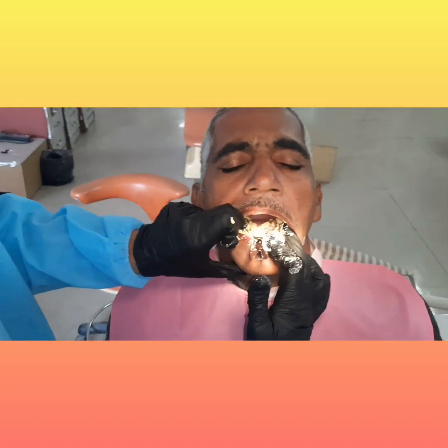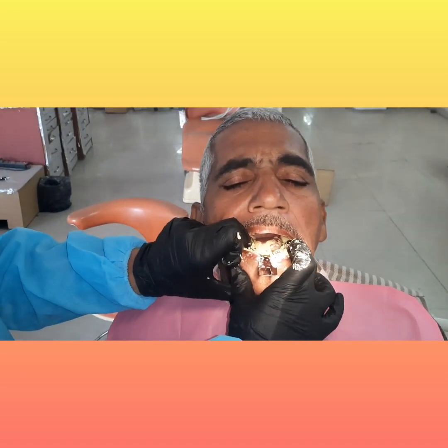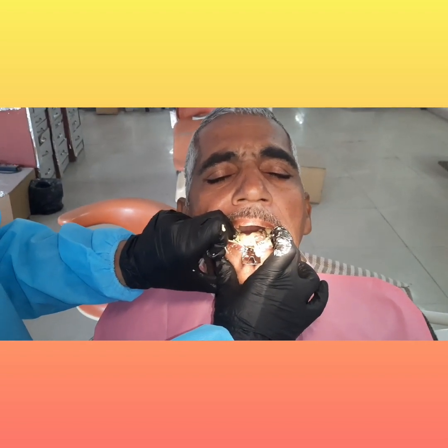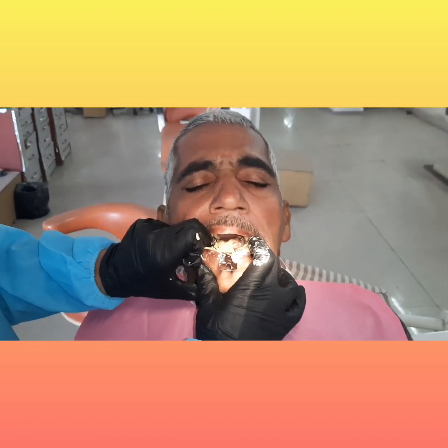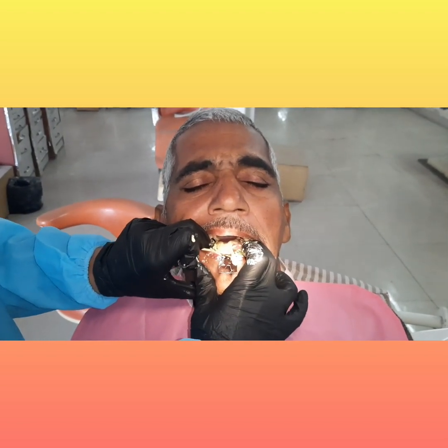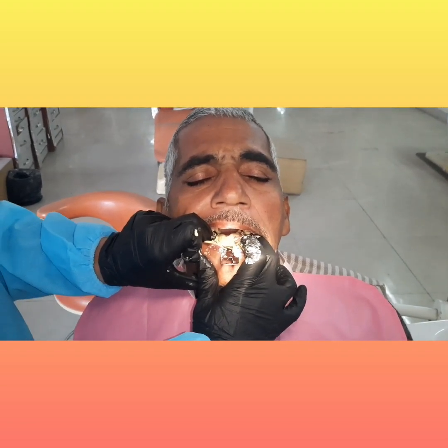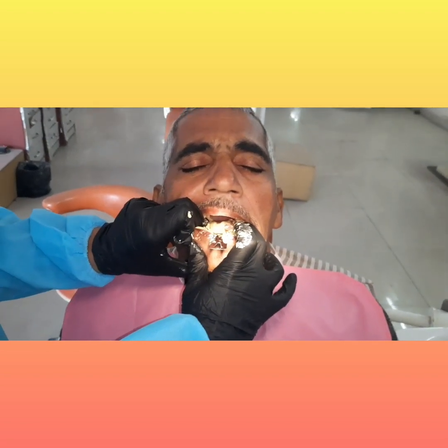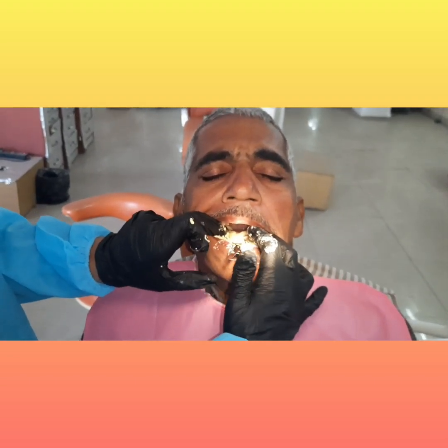The uses of alginate impression material: it is used to make impressions for dentulous and edentulous patients. It is used to make study casts and study models. It can be used as a duplicating material, since alginate and agar-agar, which is a reversible hydrocolloid, can be used for duplication. It is also very commonly used for making impressions for maxillofacial prostheses.